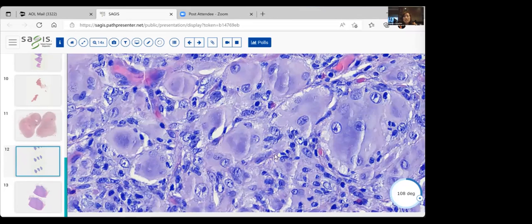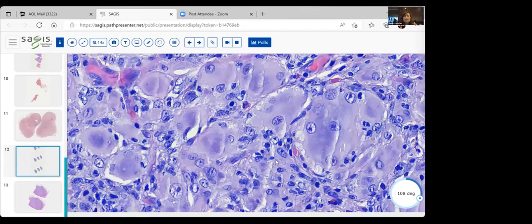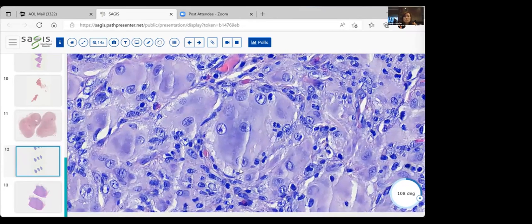You see this has 3 nuclei, or look at the size of this one, multiple nuclei in a multinucleated cell with two-tone cytoplasm. So if this person has a singular lesion, one nodule, you can call it a reticulohistiocytoma.